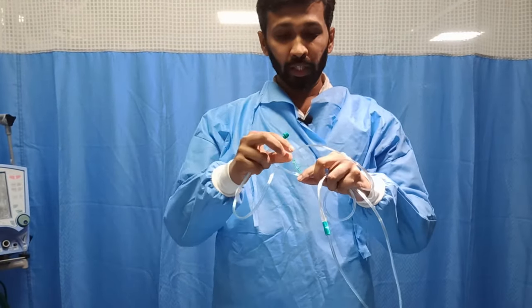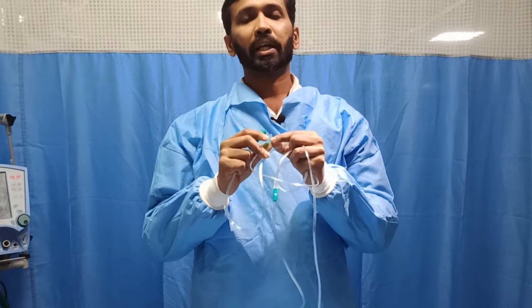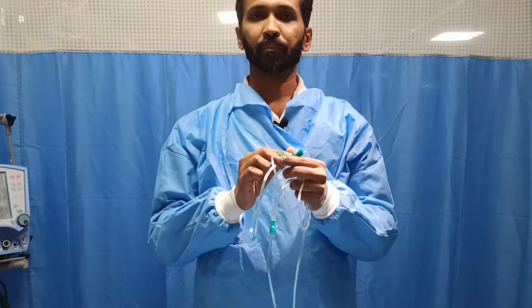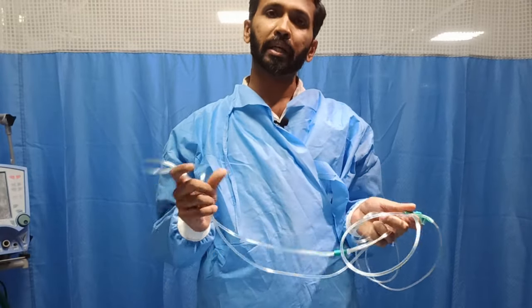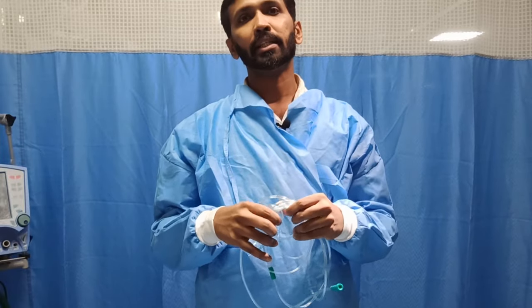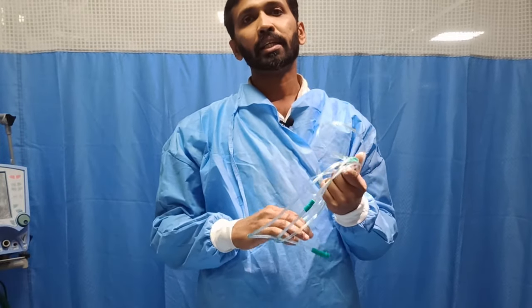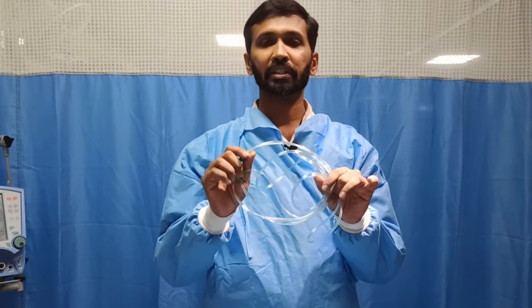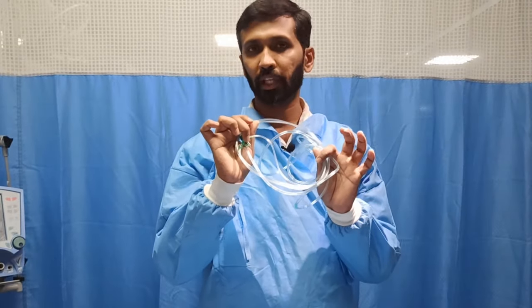So how much SpO2 can be attained, or how much FiO2 can we deliver using nasal prongs, is our question. Nasal prongs are mainly used with an oxygen delivery of 2 to 6 liters per minute, so that the patient's necessary SpO2 is attained. More than 6 liters per minute cannot be given through nasal prongs. Anyway, it's the first and the simplest low flow oxygen delivery device.